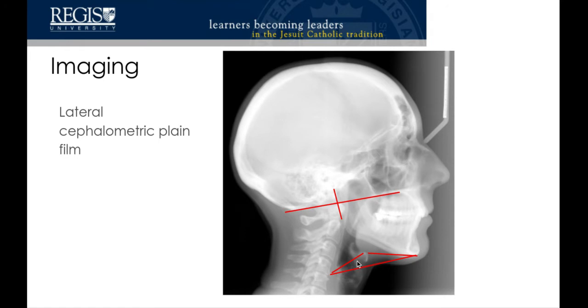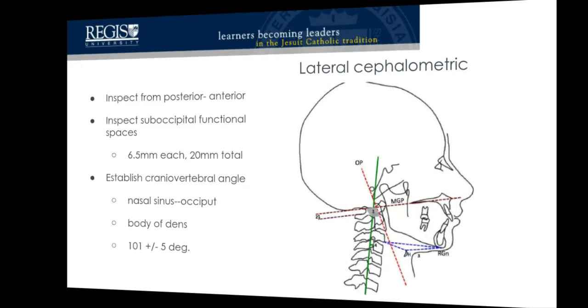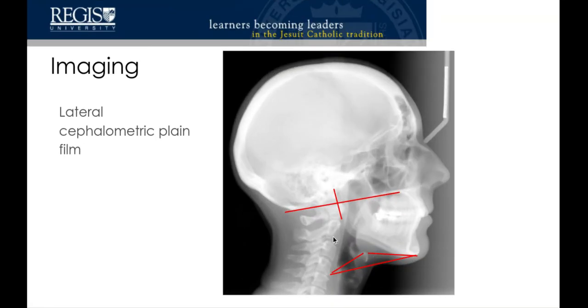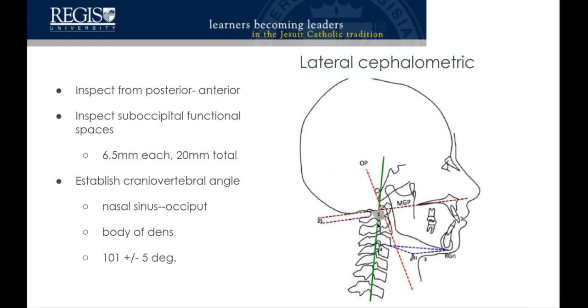And then if you come down here, this looks funny, doesn't it? Because if you go from C3 back up to the hyoid and back, you end up with a triangle that's not quite how it should be. It's inverted. If we go back here, you can see the point of that triangle is supposed to point downward, whereas here it's pointing upward. And again, here, if you look at the body of the vertebrae of the cervical spine, they're all anterior to this line that comes down right behind the hyoid.